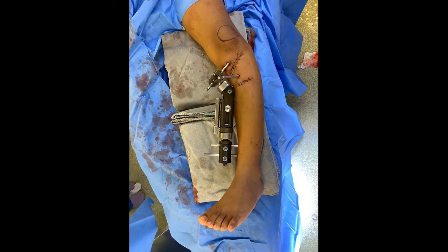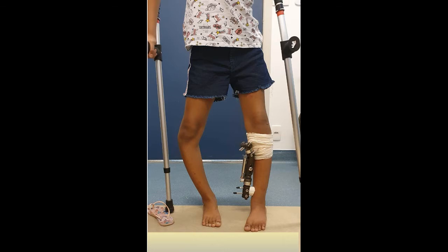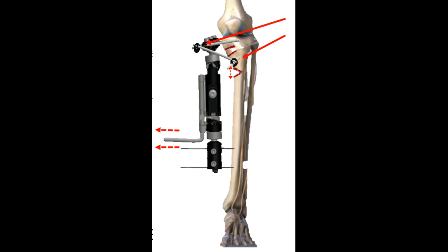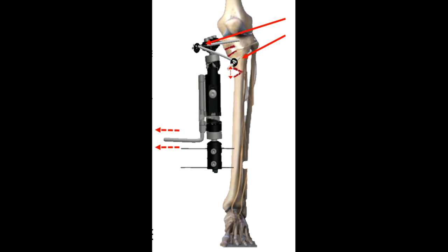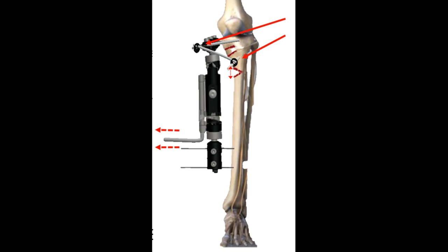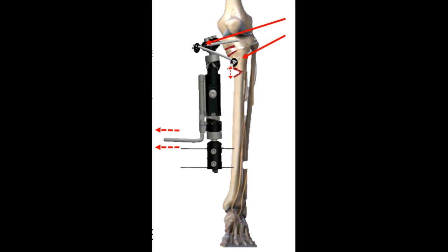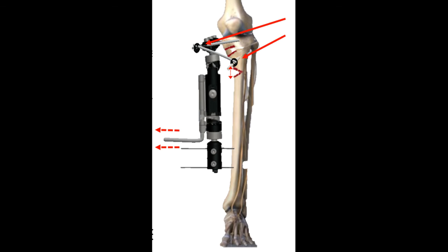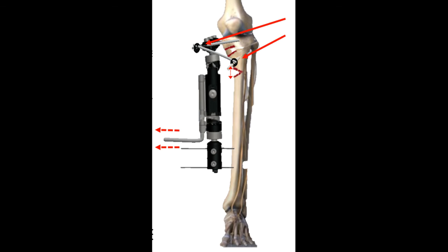We observe the patient in the immediate postoperative period, performing partial weight-bearing with the aid of crutches. After 10 days postoperatively, we start the opening of the fixator with a quarter turn of the compression-distraction unit every 6 hours.